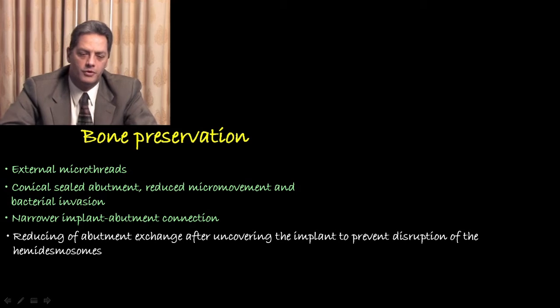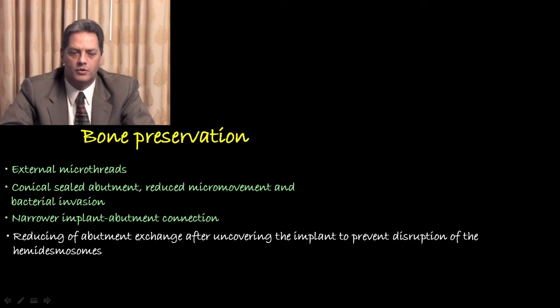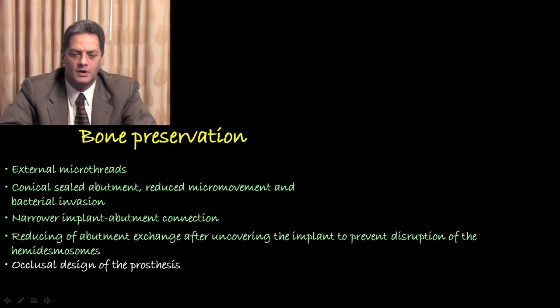And with all those variables, I believe that further research needs to be created, even though the trend is to actually try to minimize changing of components that are going to be at the bone level. So if possible, we would like to place the abutment as a final abutment as early as possible, not to disrupt that connection.